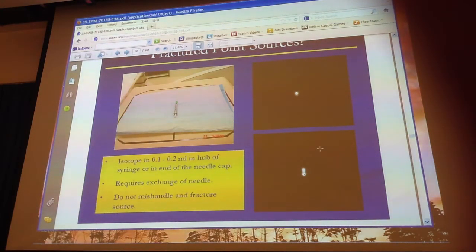No idea. Mr. Singh? Maybe the pulse shaper? Not the pulse shaper. Okay, you have a ratio circuit, right? The ratio circuit is what determines the position. Okay? When you turn on more than one window, you're turning on more than one ratio circuit. So each window, like in most gamma cameras, you have a maximum of 3 energies that you can image. Each time you turn on one of those, that's a whole separate circuit. It's like you've got 3 different gamma cameras.